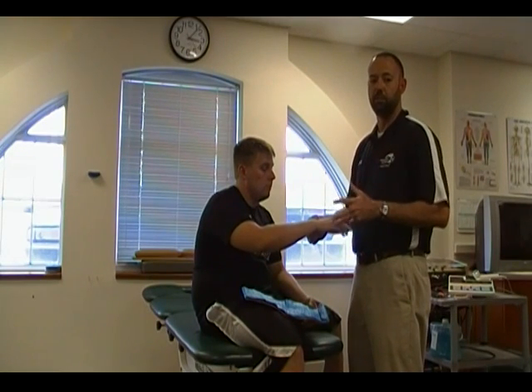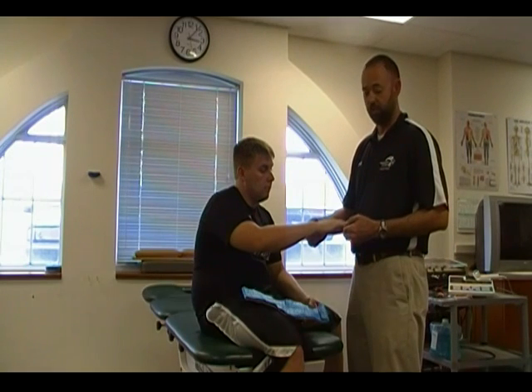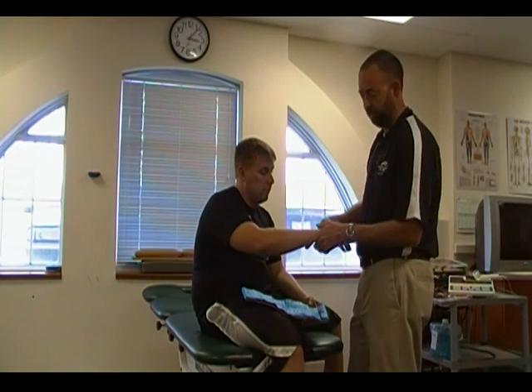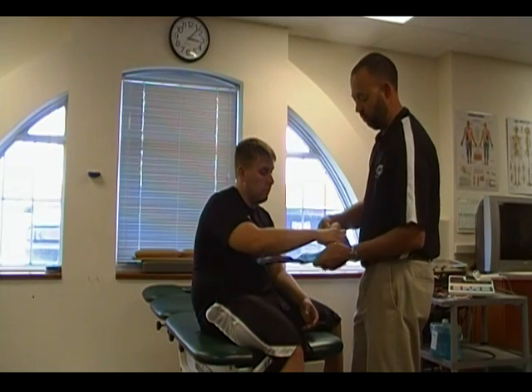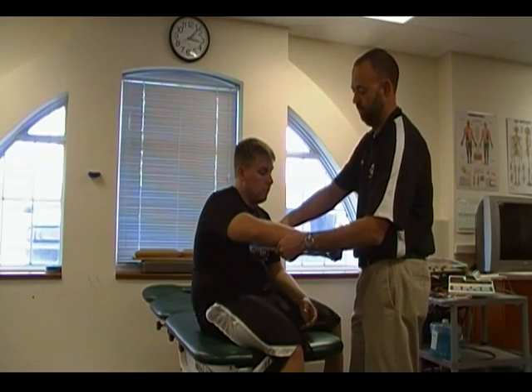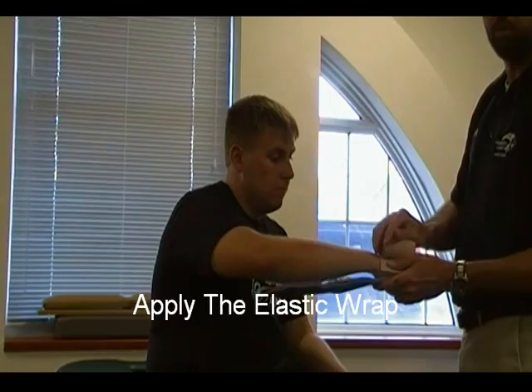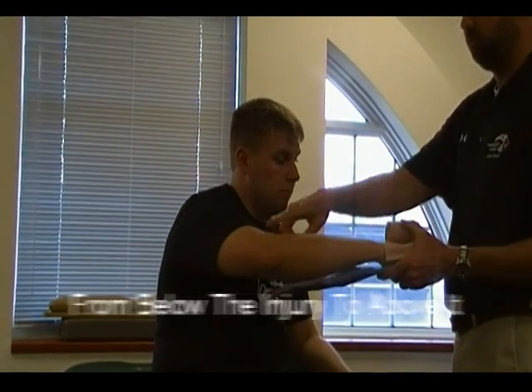Whenever you have a suspected fracture, the first thing you want to do is make sure that you check for circulation. You can check with capillary refill, you can also check for a pulse. Our patient here — let's say that he's fractured his forearm. So we're going to want to stabilize that injury, mold our splinting material as necessary, and then we're going to apply our elastic wrap from distal to proximal.